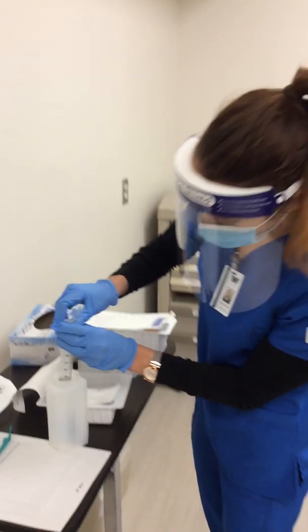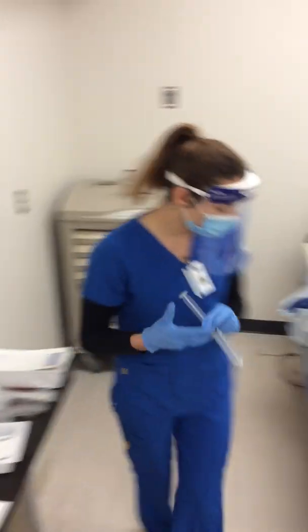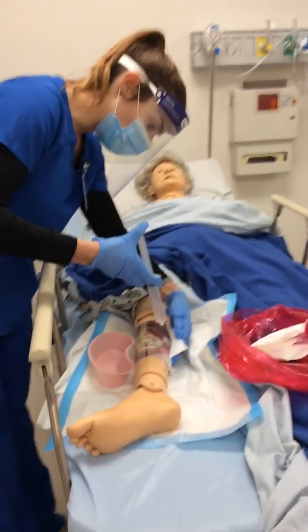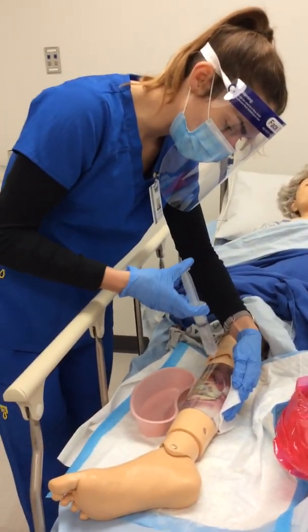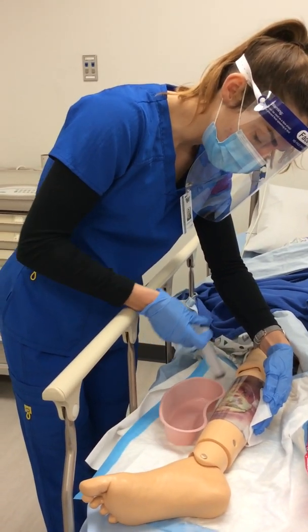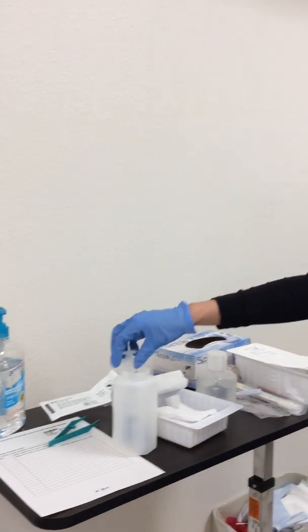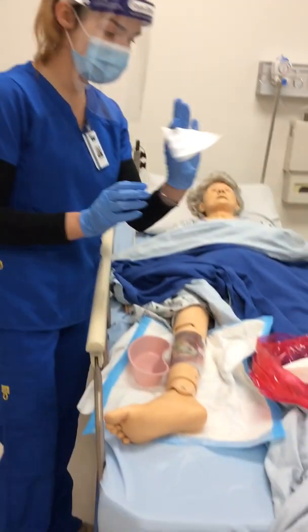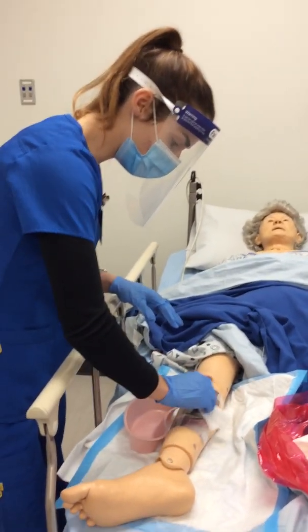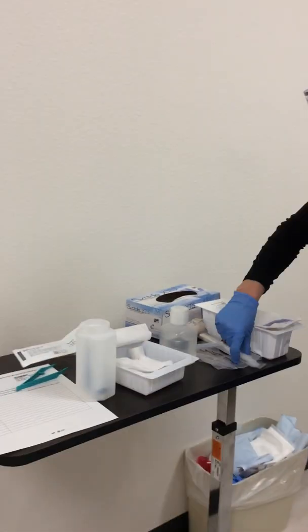We're going to draw up 30 mils of normal saline. Holding the AngioCath tip about 2 inches away, we're going to go starting from the top to the bottom. You'll do this until you get a clear return. Okay, that looks good. We'll set this over here, and then we'd get a new gauze, pat it dry. Doing okay, Shirley? Good.